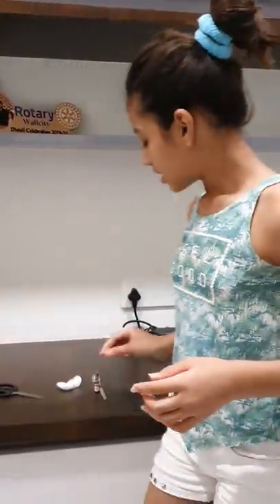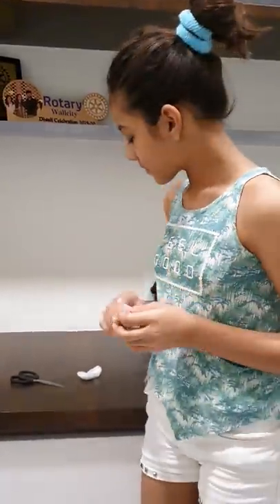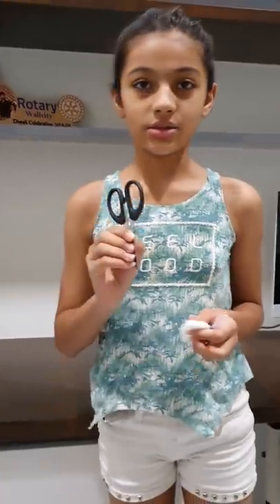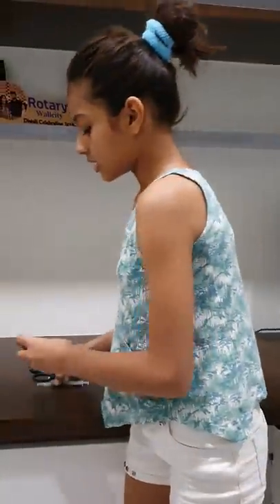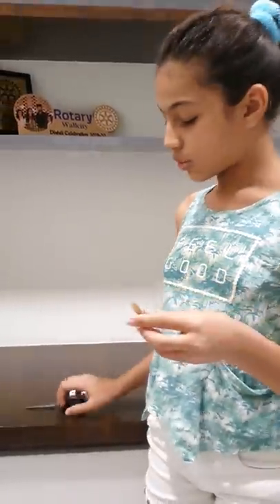Hello guys, so today I will teach you how to apply injection. For that you will need very basic things: the syringe and the medicine you are going to give, a cotton with spirit, and a scissor to cut the bottle.